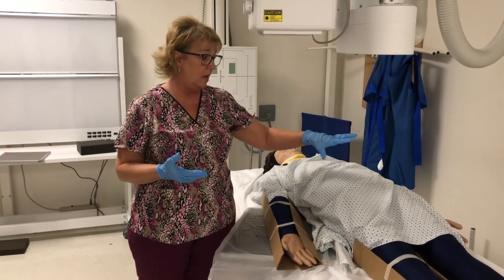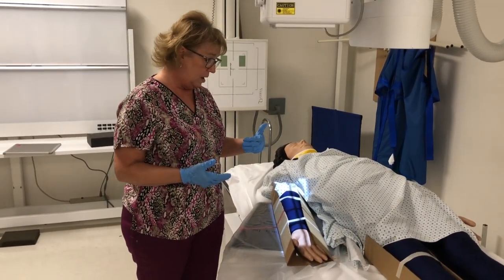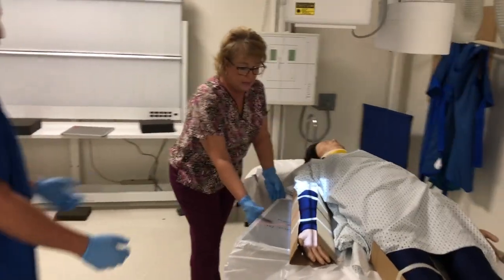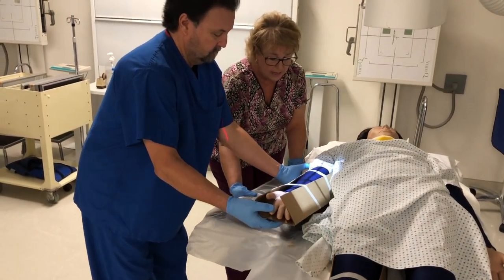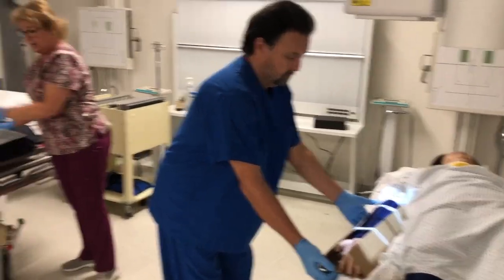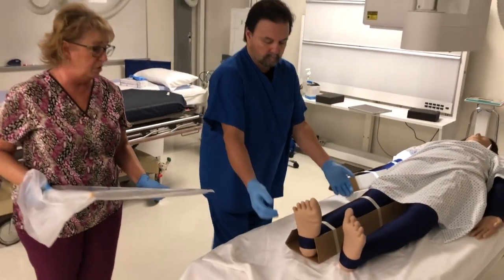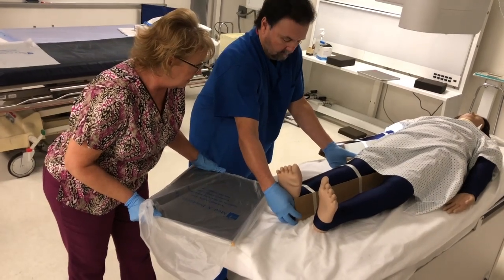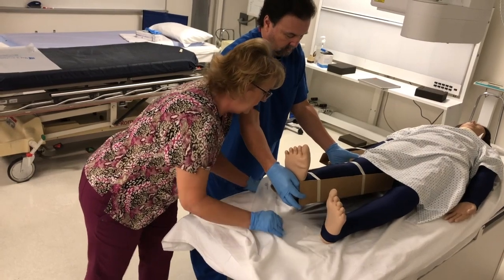a trauma patient. So if I could, I would throw a lap shield up here, expose her right forearm, okay, and then my coworker would come back in, again, help support the limb so that I could take this out, all right. Then I would bag another cassette. I would move on again and still be doing all the AP projections. So they would support the leg, only lift it up as much as necessary.